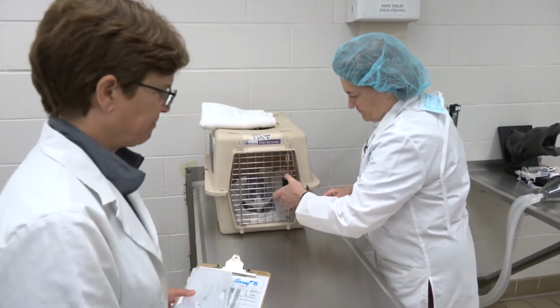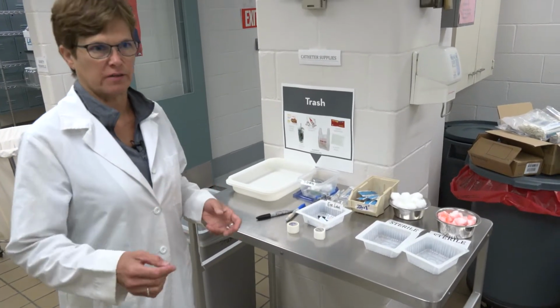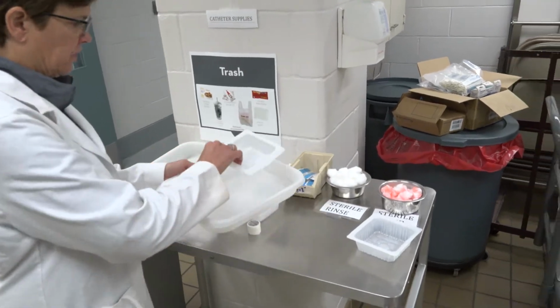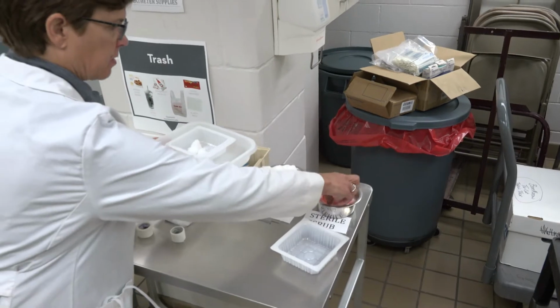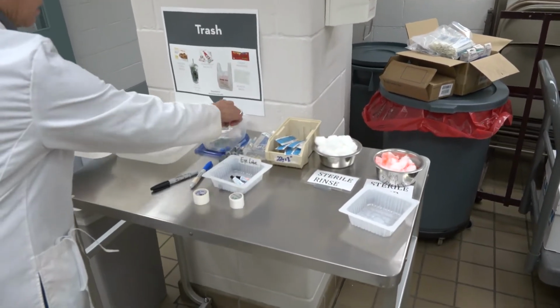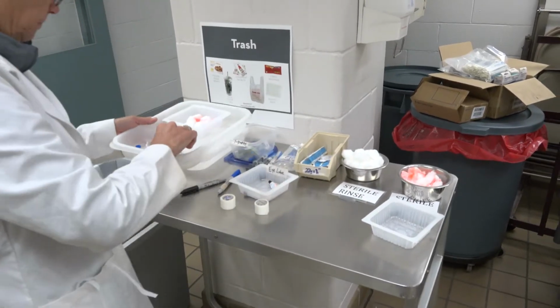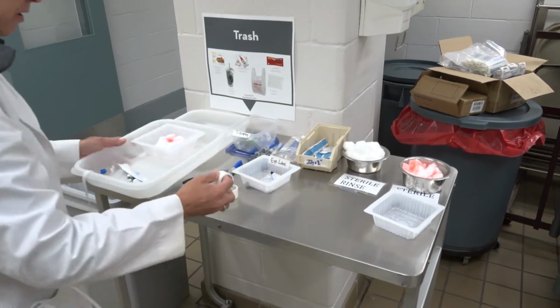So to speak. All right, so our cat has been pre-medded. We noted the time. The other anesthesia person is with that. I'm going to gather catheter supplies since we're waiting. I'm going to grab a tray, a boat. I'm going to put 3 rinses and 3 scrubs in there, and T-port, eye lube, catheter. Someone else left a tape, so I'll use that, and I'll bring some other.